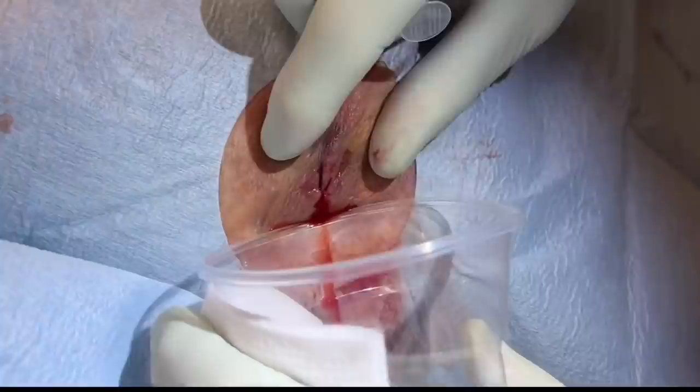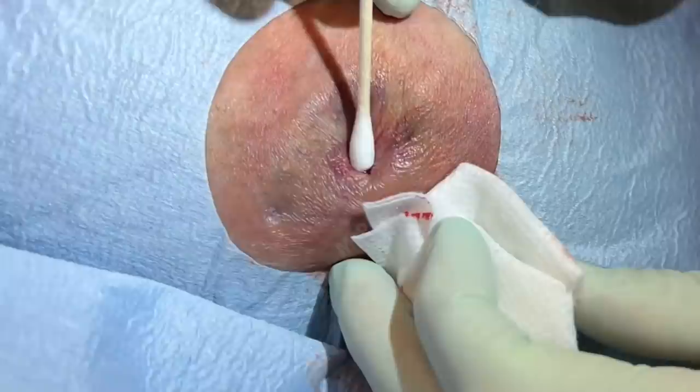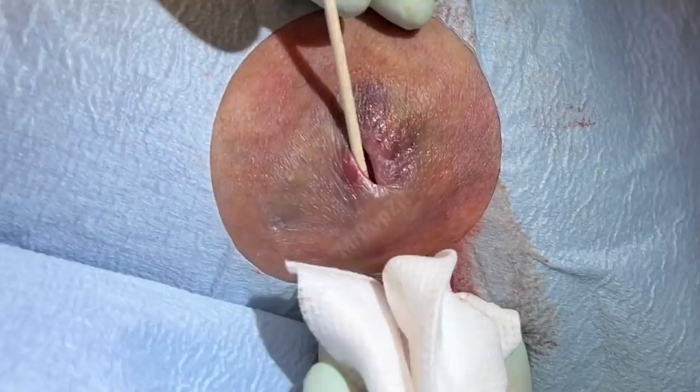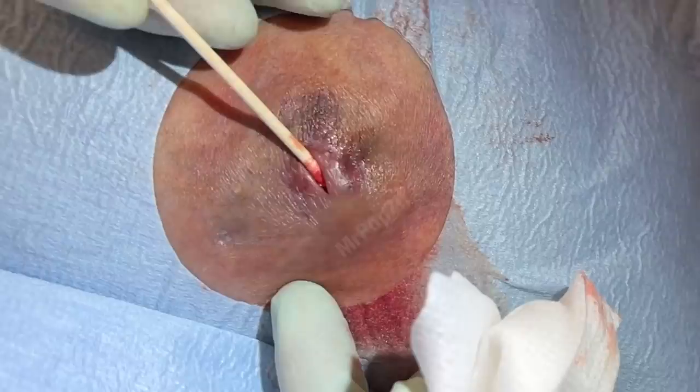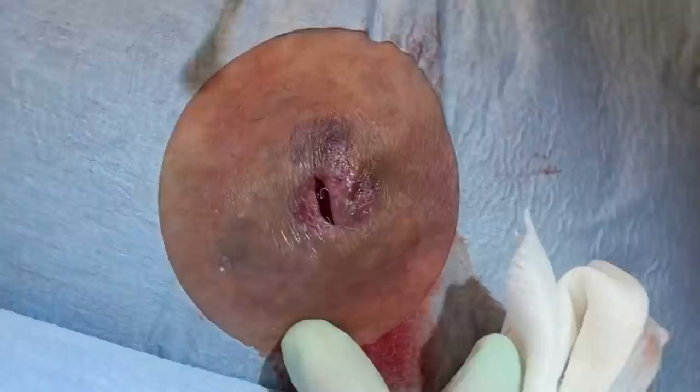It puffs up and then just rinses out — just little tiny bits, but not bad. There's a little bit of blood in there too. So relieving that pressure, you can see this tissue just kind of folds up now because it was so stretched out. I'm going to do a little Q-tip here. Just gently caressing the bottom, left to right, to see if we can get any contents to stick to that dry cotton. Going all the way over to that pore — you can see this is a big pocket there. What I'm looking for is any cyst contents.